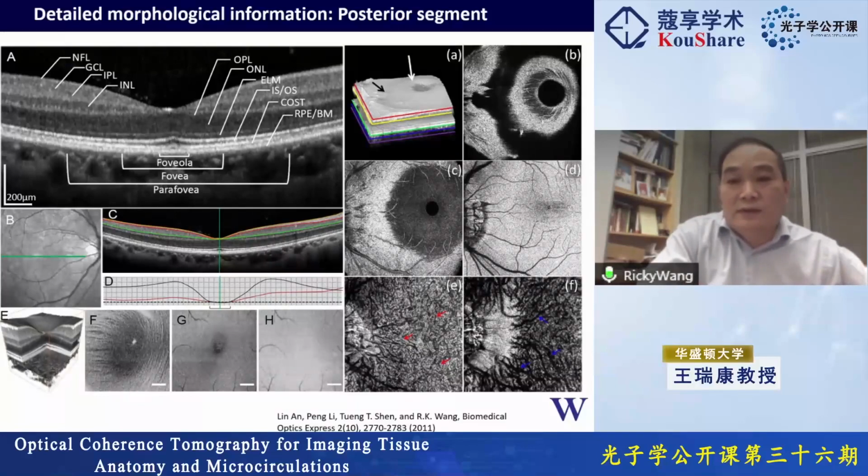So image processing and data size reduction to give simple values is a very important research area in the OCT system. Even machine learning and deep learning now kick in to give fast, simple values to the clinicians. This really includes segmentation. For example, you can look at the segmentation of the nerve fiber layer, and you can measure the thickness of the nerve fiber layer.